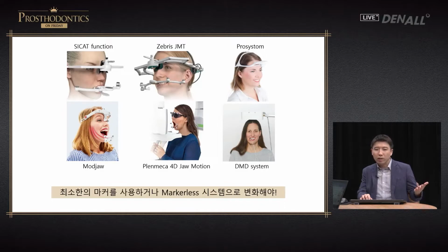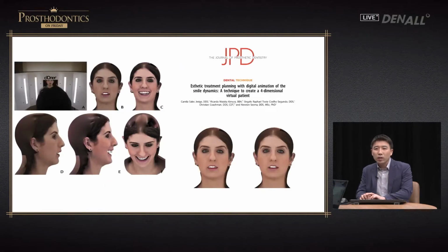Along with a facial scanner, when you integrate these data, you'll be able to get a true 4D virtual patient. Such attempts are actually being made even now. There are reports about the 4D virtual patient. This has been reported in JPD. Using different facial scan data, the patient smiling or at rest, when you simulate it, you can artificially check the expressions that the patient did not actually make. Different attempts are made, and there are many technical papers in this area. I believe there will be many advancements.